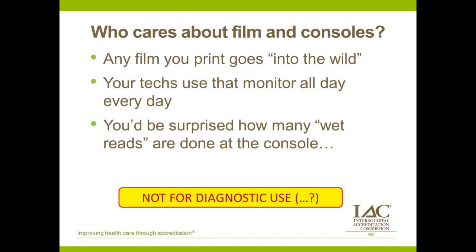And the other thing is, just as someone finishes the words coming out of their mouth, no one ever reads anything at this console. I'll see a cardiologist walk in, I'll see an emergency physician walk in, and they'll put a hand on the MRI tech's shoulder and do a friendly, hey, how's it going? How's the patient doing? As they're leaning in and peering at the screen. So whether or not you think your MRI console is being used for quote-unquote diagnostic purposes, physicians are looking at it, and they are making snap clinical judgments based on that so-called wet read. So we want to be careful about that.